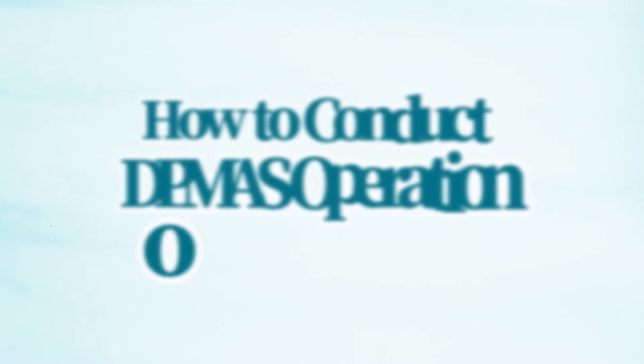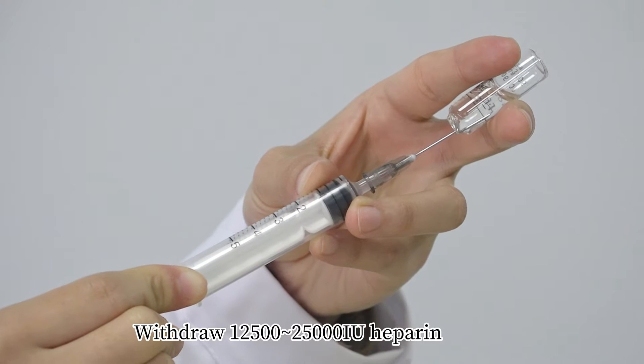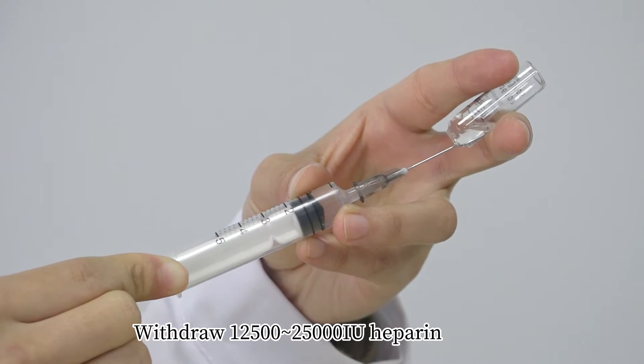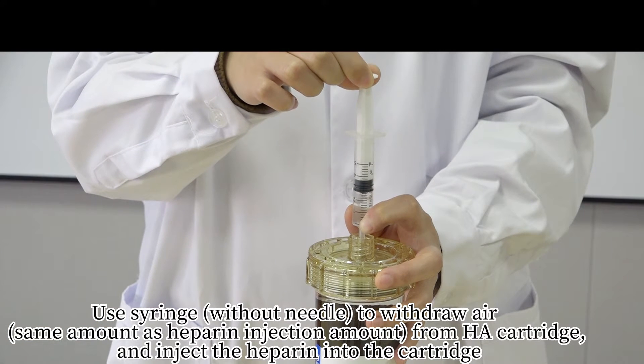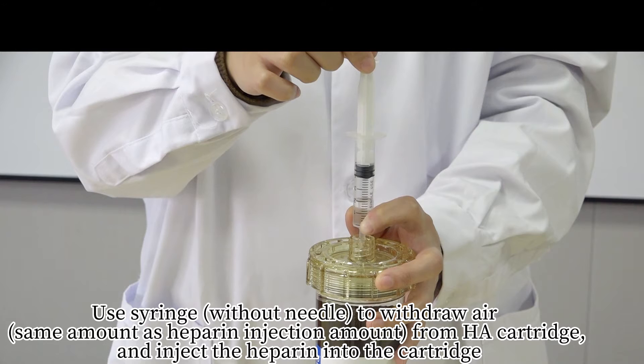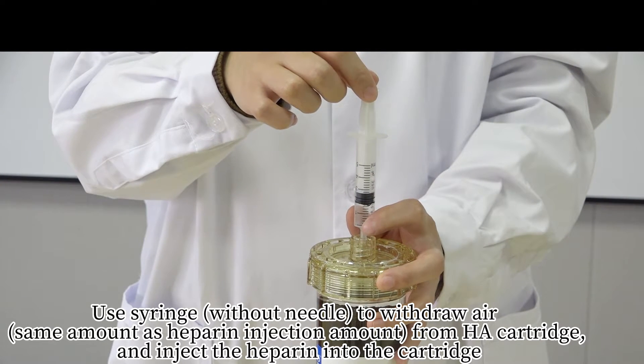How to conduct a DPMAS operation on the F-20 machine. Withdraw 12,500 to 25,000 international units of heparin. Use a syringe without a needle to withdraw air from the HA cartridge and inject the heparin into the cartridge.